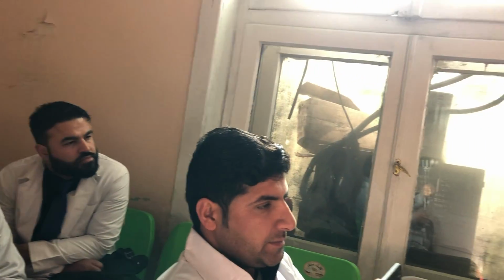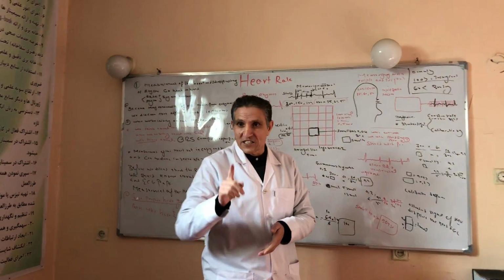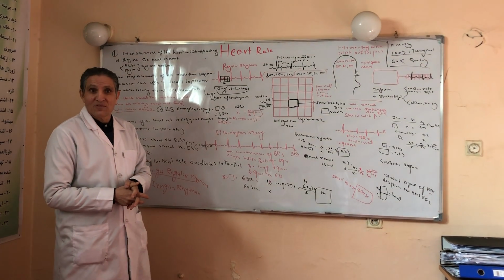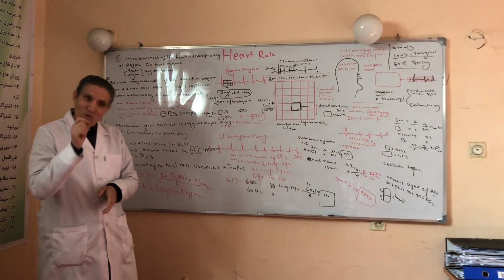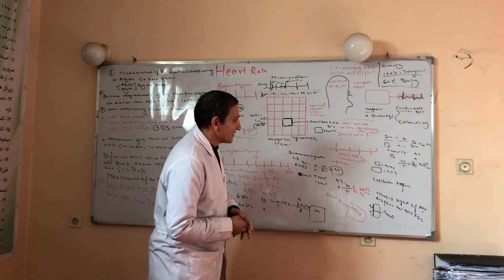Standardization of the ECG machine is characterized by two things. The first is constant rate, constant speed. It means 300 large squares move under the needle of the ECG machine within 60 seconds. So 60 seconds is equal to 300 large squares, and 300 large squares equal 60 seconds, or vice versa. In addition, 5 large squares take 1 second to move under the needle, so 1 second is equal to 5 large squares, and 5 large squares equal 1 second.